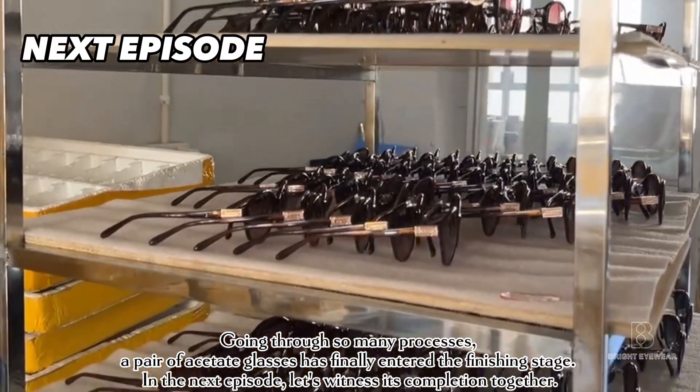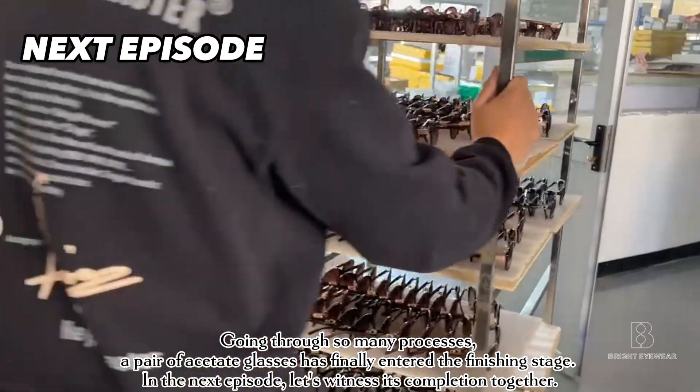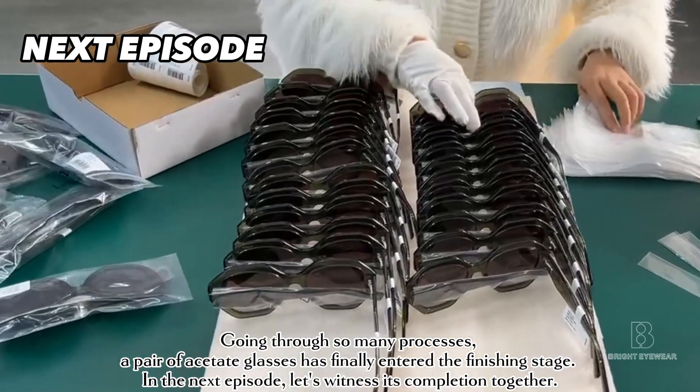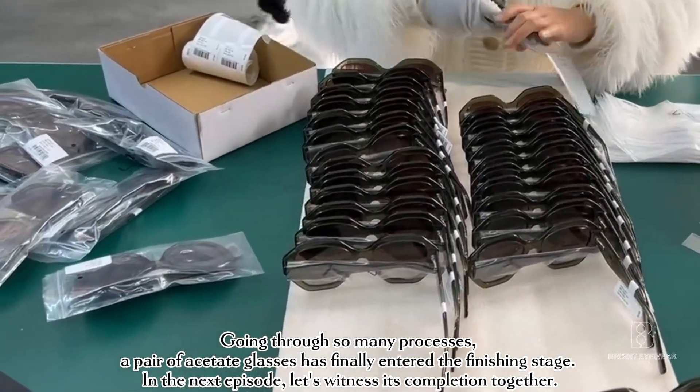Having gone through so many processes, a pair of acetate glasses has finally entered the finishing stage. In the next episode, let's witness its completion together.